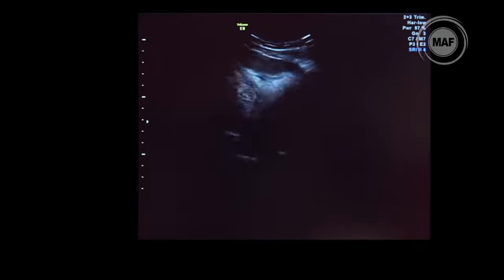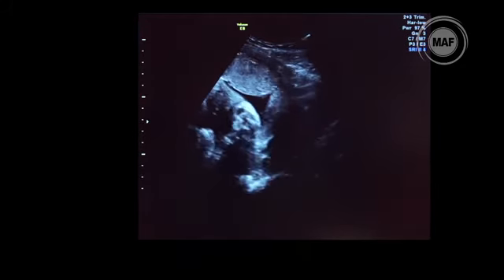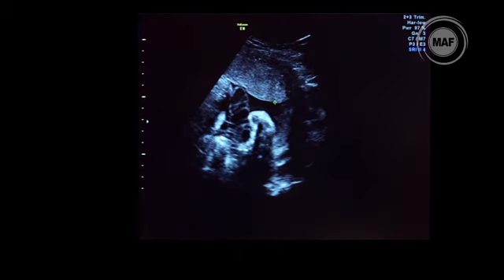Okay, so there's nothing there at the moment. So this pocket is 0, and the last pocket, as you can see here, and that's the last pocket. And this fluid gives you what the total fluid level is, right? And that's plotted against the chart to say whether it's reduced or not reduced.